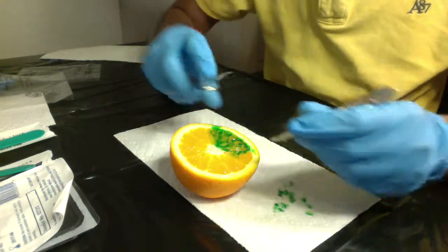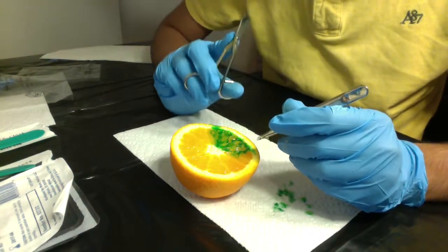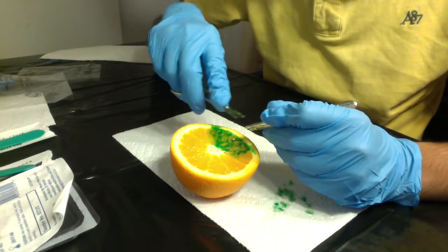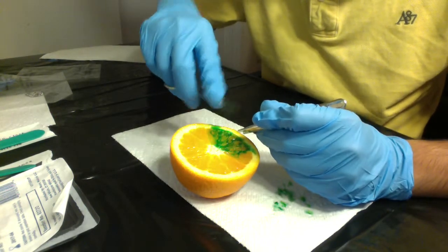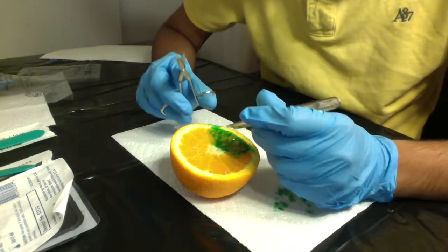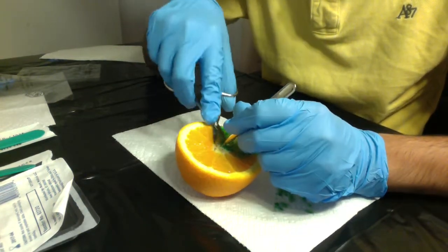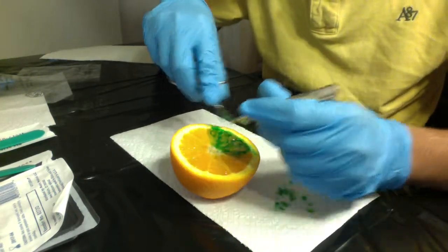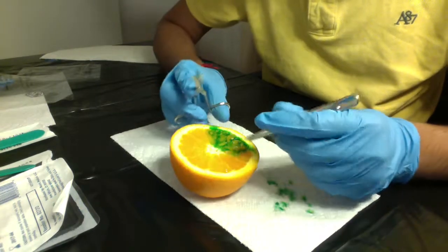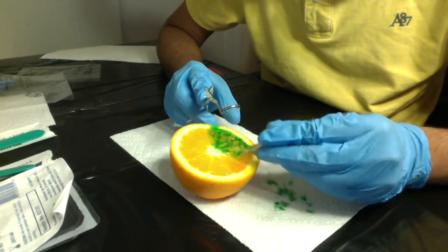I found it a little difficult to keep my hands stable on the surface in this position, probably because of the arrangement of the orange, and I might have to lift my forearm. I tried practicing putting my hands down, but the accuracy goes down if I do that.